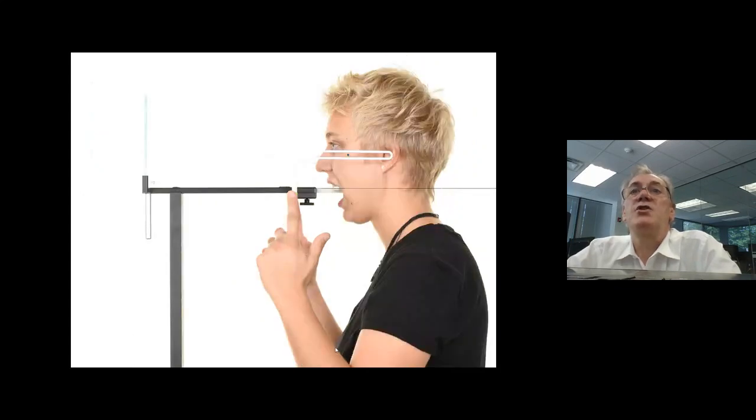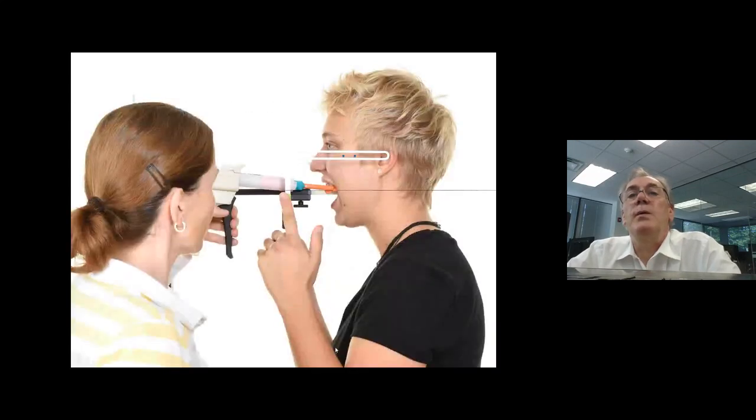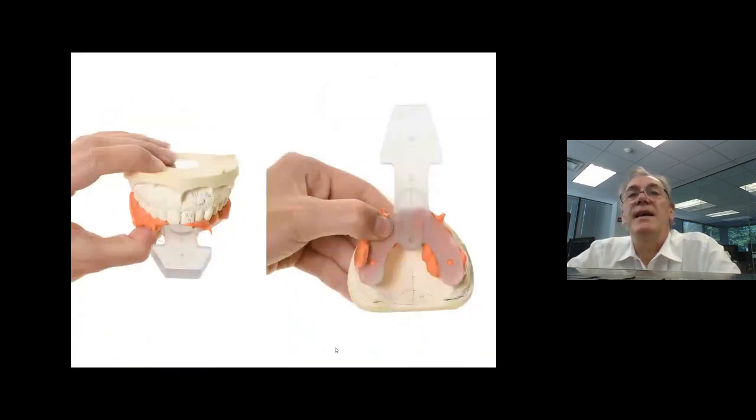And between those slots, we will locate two points, two dots, which are going to be our reference points. And the patient will walk up to the plane finder two or three times so we have the opportunity to verify that these markers fall constantly in the same position. This is determining the stabilized and reproducible position of the head. Once it has been established, we will then fix it by means of some bite material and transfer this information into a physical articulator.